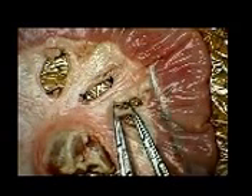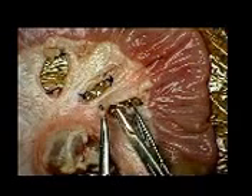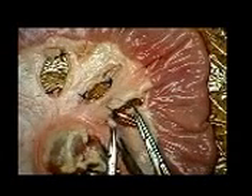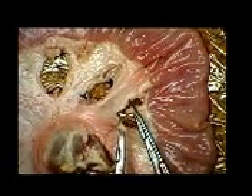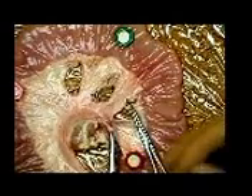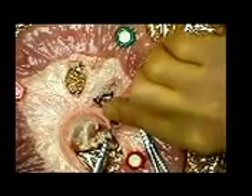Two hemostats are applied and the vessel divided, leaving an adequate cuff as shown previously. Using a monofilament suture, the curved needle is passed through the centre of one pedicle. For the first method, the suture is tied first with a backhand throw around one side of the pedicle. The two free ends are then passed beneath the hemostat to the other side of the pedicle. After the next throw is created and tightened down, the hemostat is removed. Further throws are created to complete the knot.